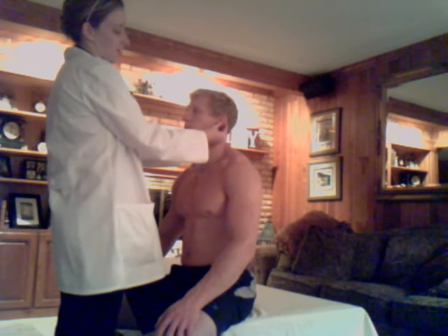Next, looking at the ears, they are symmetrically placed. Palpating the ears, the auricles, they are non-tender. Next, I will look into the ears. Noticing that the tympanic membranes are pearly gray and the auditory canals are clear.